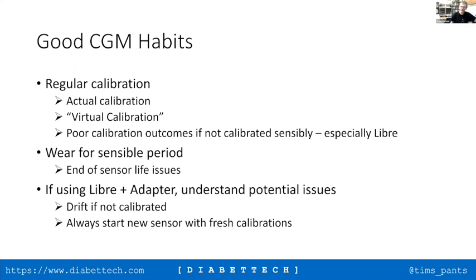One of the other nasty things that some people do is they get the reading from the Dexcom app or from the Libre reader, and they use that for the calibration because they don't have to prick their finger again. Yeah. And that is a recipe for disaster. Yes, a self-fulfilling loop of a different kind. Yeah, don't do that. That's a very good point, David. So those are the key points around using the CGMs.